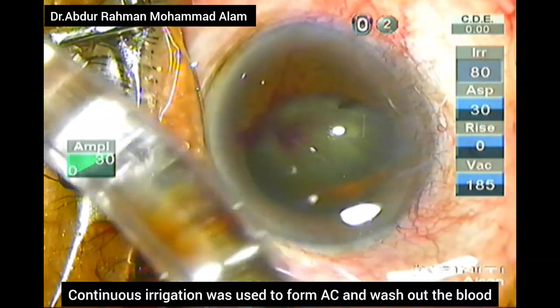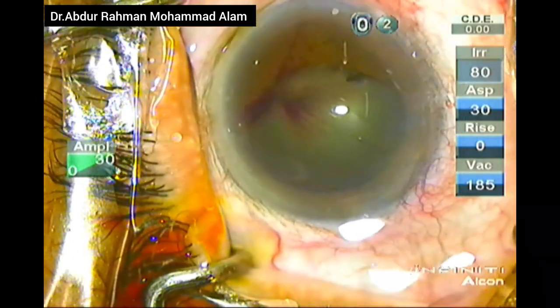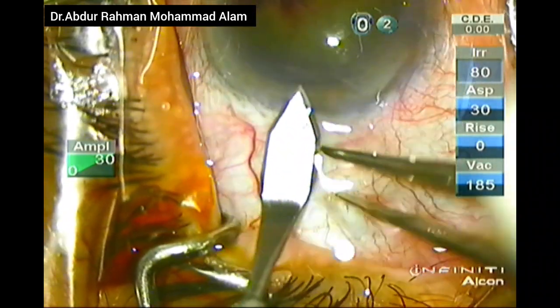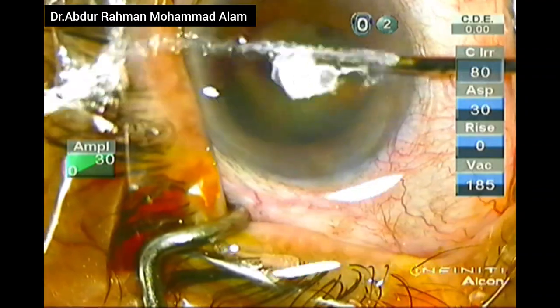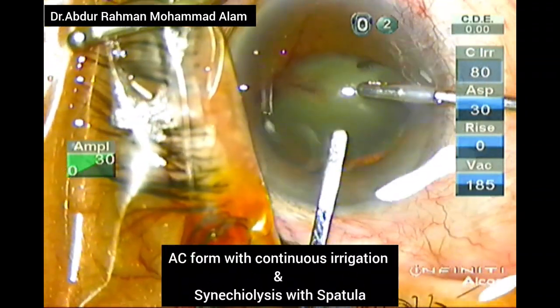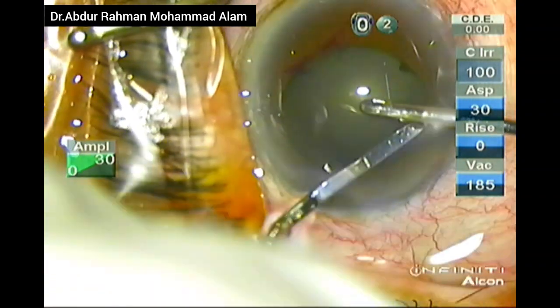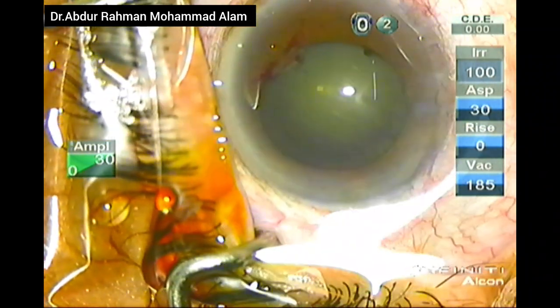I already made the side port. Now I am using continuous irrigation from the irrigating handpiece to wash out the blood from the AC. The main port is being created with the help of a 2.4 steel keratome, stabilized with the Hoskins forceps. Now I am forming the AC with continuous irrigation and gentle synechiolysis is done with a blunt spatula.